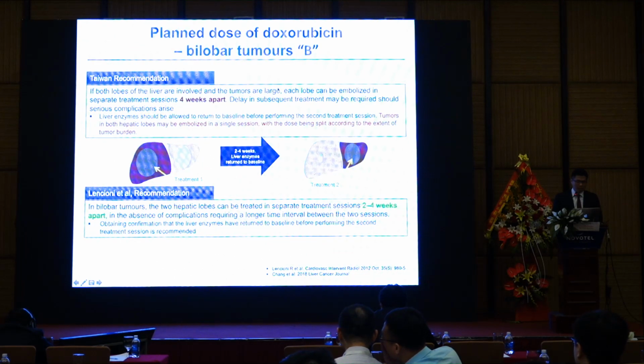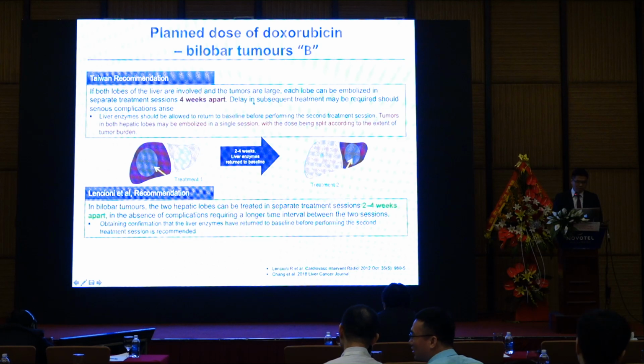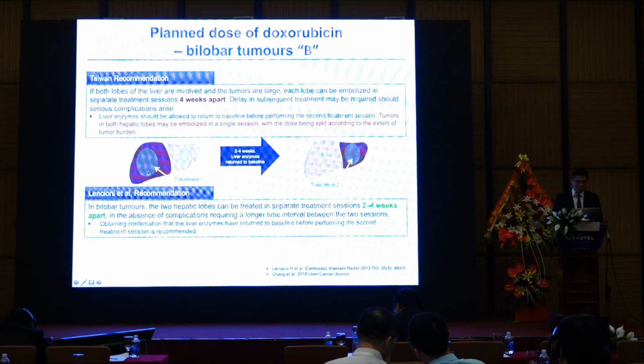So if there is a bilobar big tumor, sequential treatment 4 weeks apart is reasonable. But of course, you can treat this kind of tumor in one session, but you should make sure that all the tumor is adequately embolized, or you can do the sequential treatment.